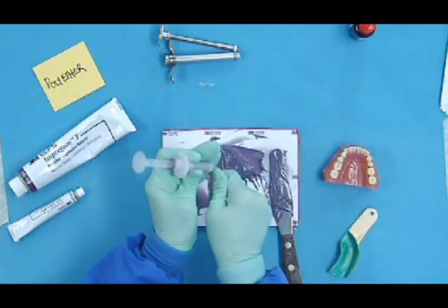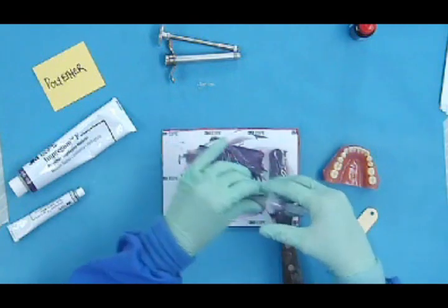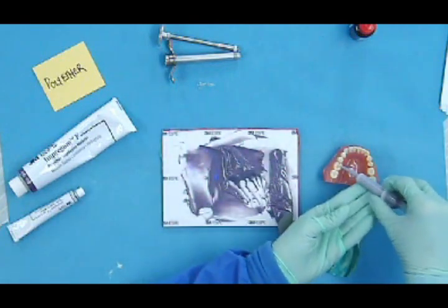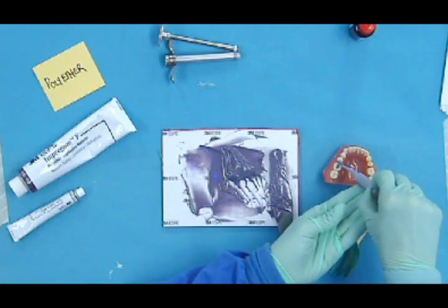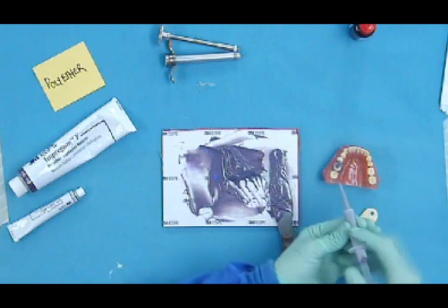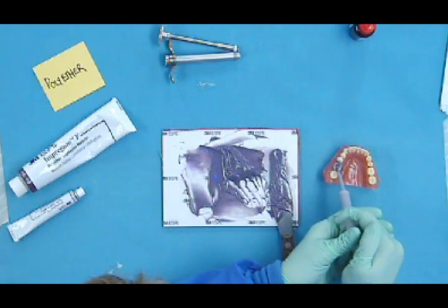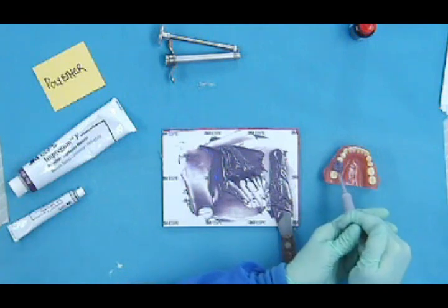Sometimes the doctor likes for you to turn that tip so it's got a little curvature to it, but the doctor's going to be injecting that material around the tooth while you're loading the tray.